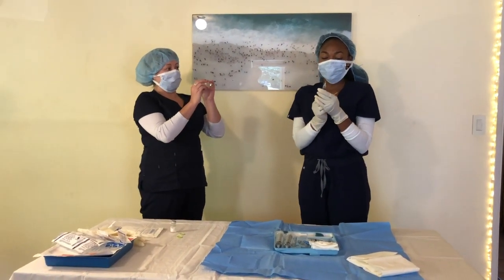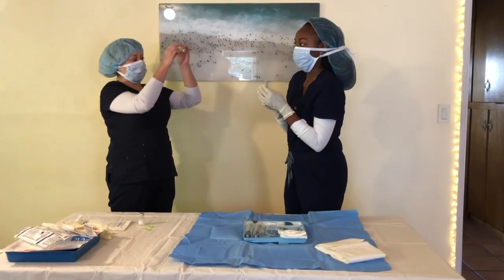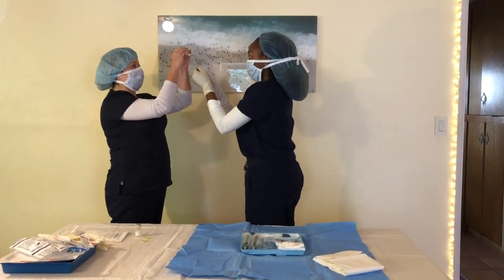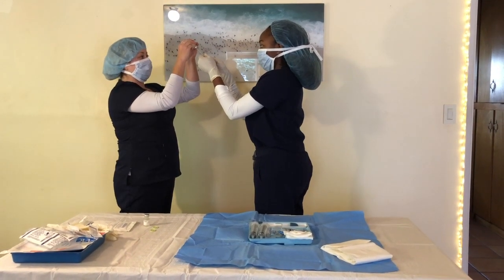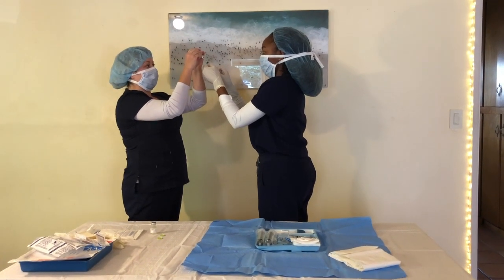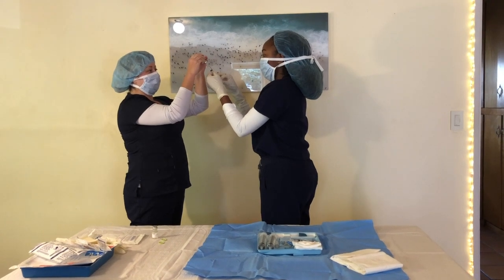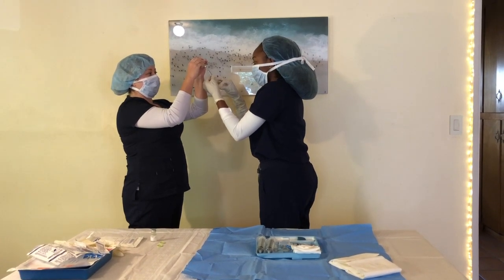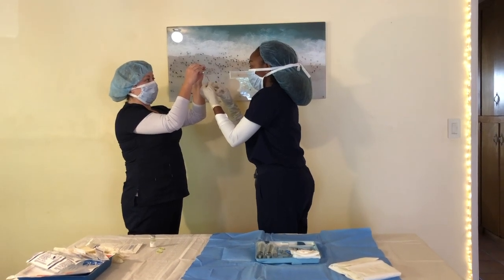I'm gonna put 4 cc's of air in, because that's what the doctor wants in the second syringe for this certain procedure. And Tegan's gonna hold it nice and firm for me, and then press down. I always like to have the holding tech press it down, just because I feel like they know how hard they can press, and I might not. So I feel like it's less likely for injury, especially since this is a plastic vial that our fluids are in. All right, so I got a big air bubble, so I'm just gonna draw again, just like that.